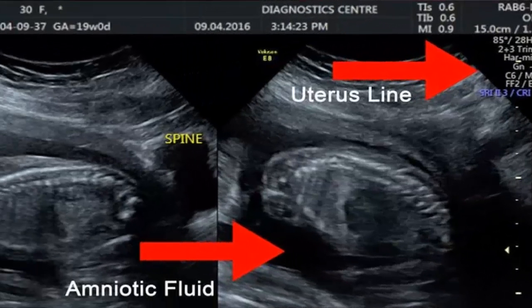2. Spot the baby. Your baby will also look gray or whitish and will be located within the amniotic fluid, the dark area inside of the womb. Look at the area within your amniotic fluid to try to make out the outline and features of your baby. The details that you see in the image will depend on the stage of your pregnancy. For example, at 12 weeks, you may only be able to identify the head of your baby, while at 20 weeks, you may be able to see the spine, eyes, feet, and heart.